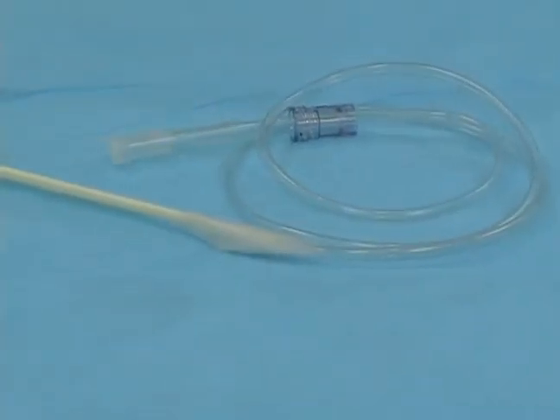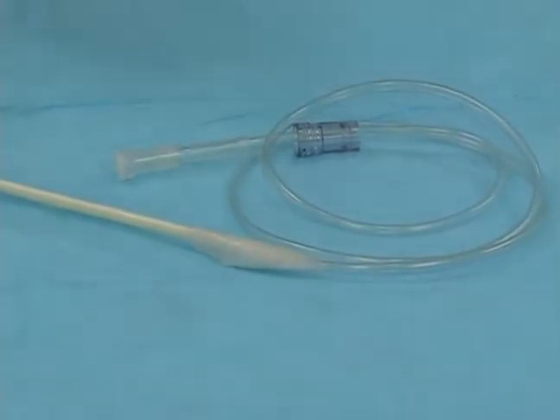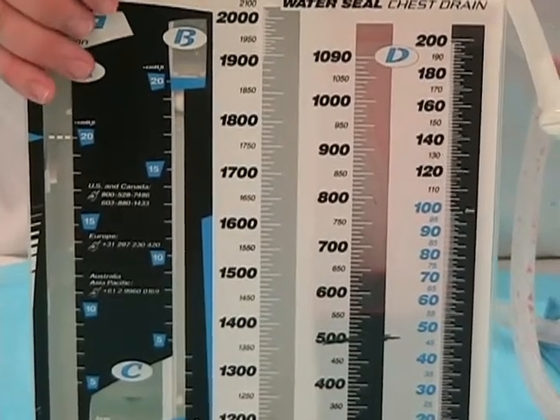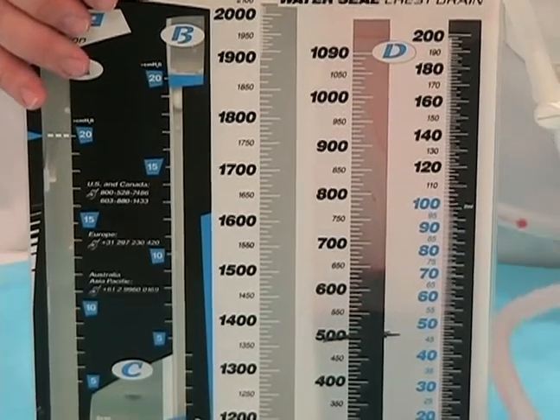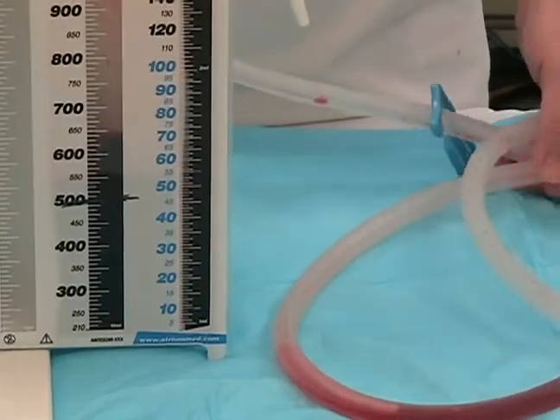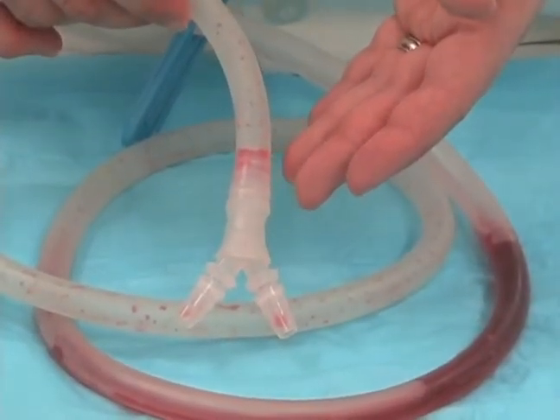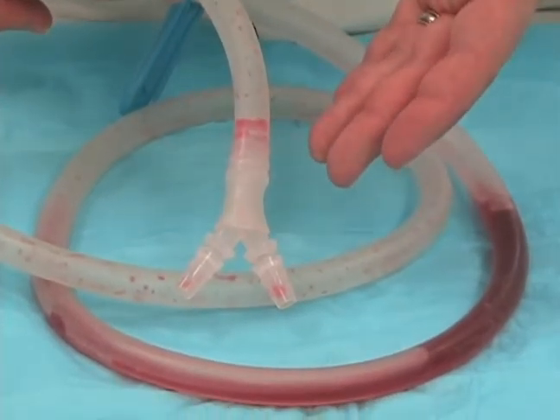Now you have a completed central line adapter that you can attach to your IV fluids drain. Here is a Pleurovac that we filled with simulated blood. The blood has been run through the tubing to give the appearance of dried blood in the tube. The Y connector is used to attach one chest tube with a simulated clot and one chest tube without a clot.